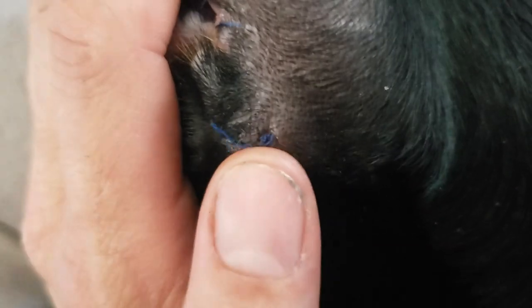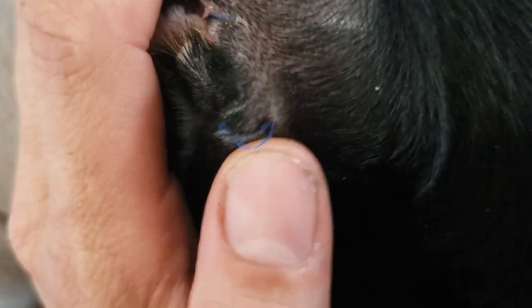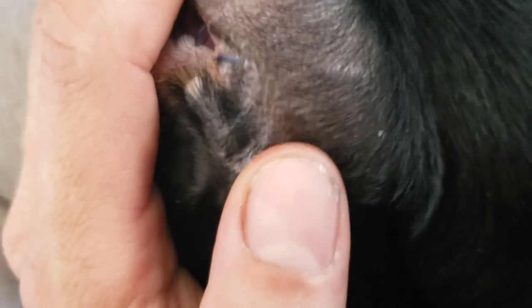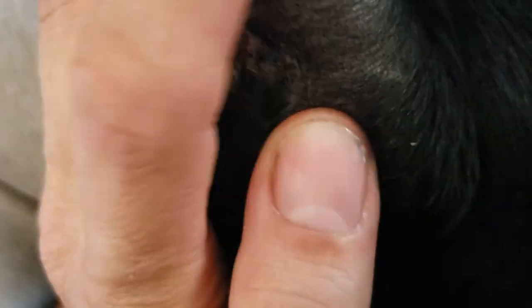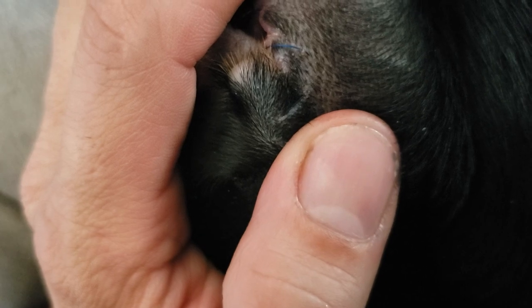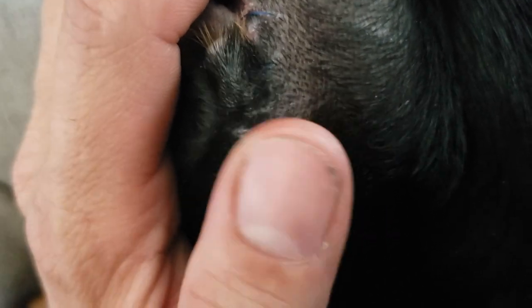This one's knotted there, so I'll get to the bottom and then cut this last knob and pull it through. I'll get it inside of this last loop, right in between there, and cut one side, then pull it out so both ends come out together. Just look for the string — I can get my tool underneath there and just get underneath the line and pull it, and it'll just come out.